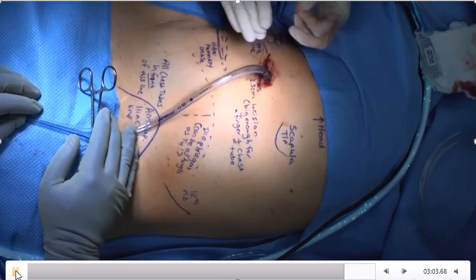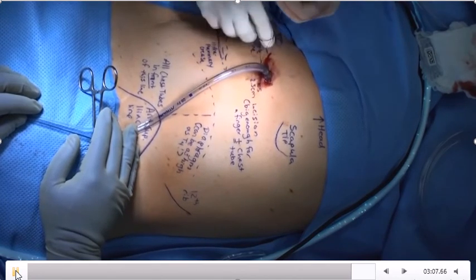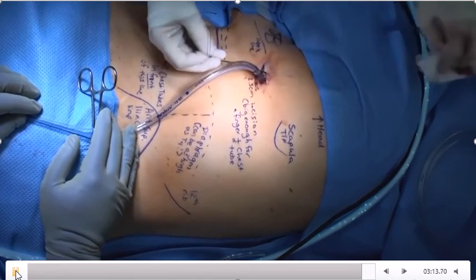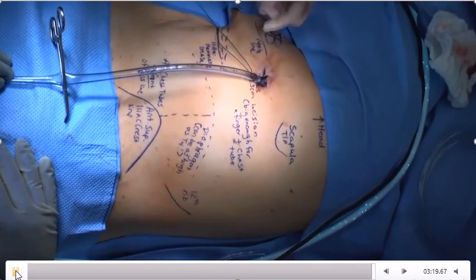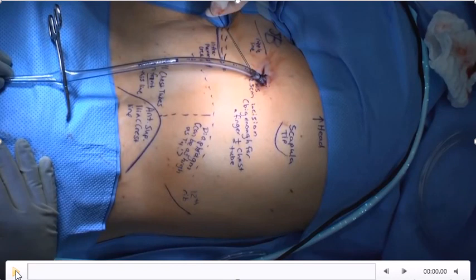Again going back and forth around the tube and taking so many knots in order to make good fixation of the tube. And now he has finished his chest tube insertion and fixation.